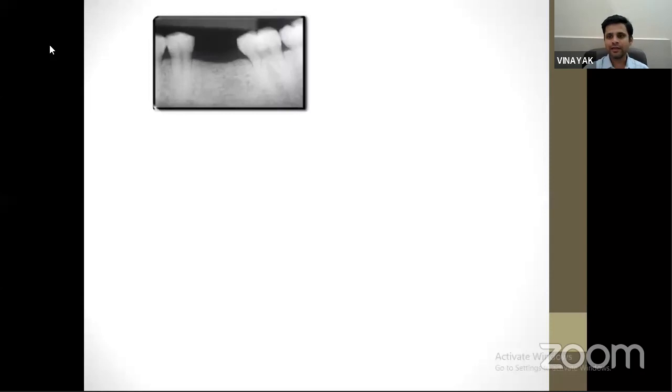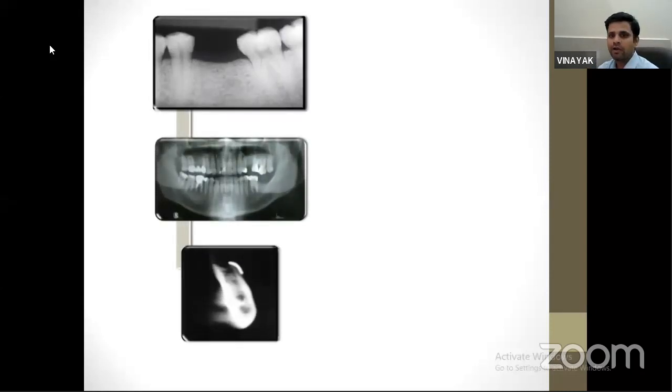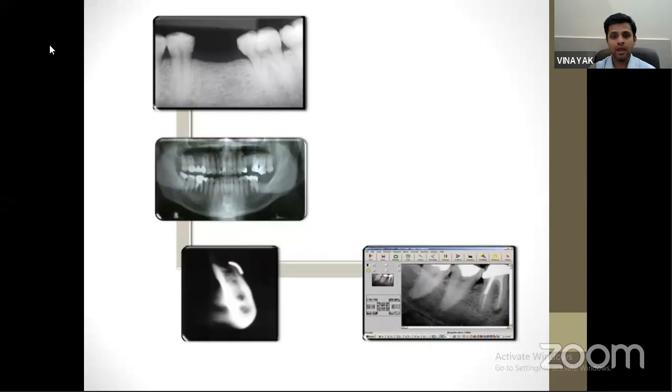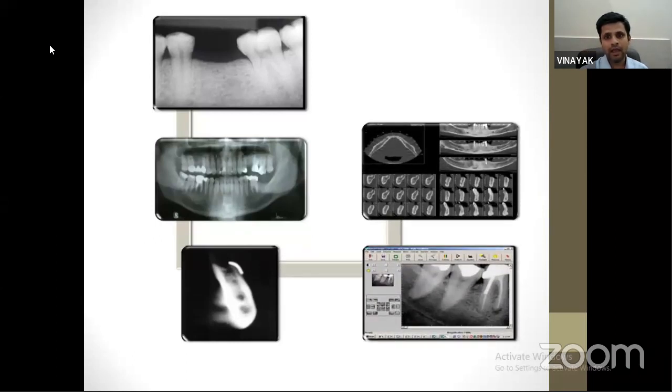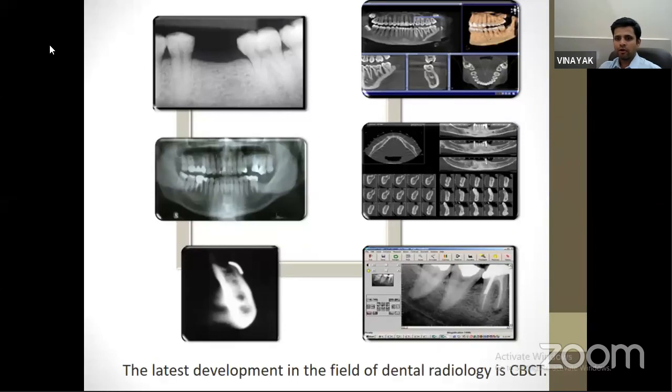These are tough times, and we have to learn from it and evolve through it, just like the field of dentistry and radiology. We have evolved from IOPA to OPG to the digital world, to CT scans, to CBCT. There were disadvantages of each, which have been overcome, and today we have reached CBCT. CBCT is the latest development in the field of radiology.